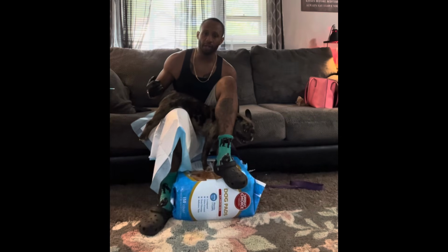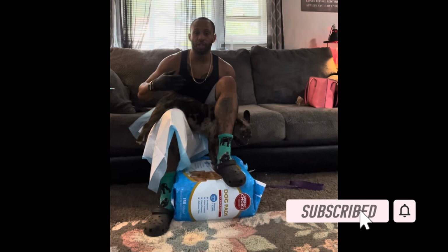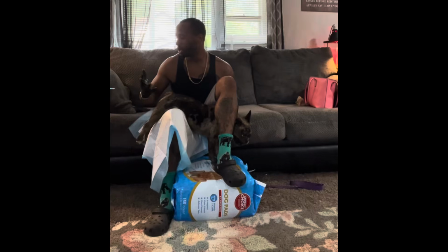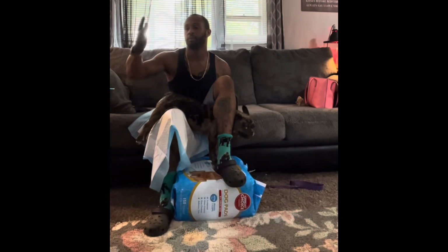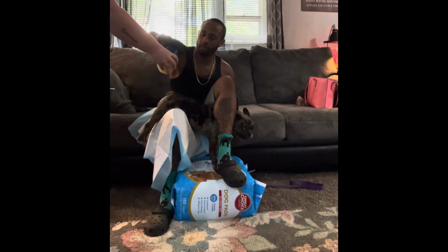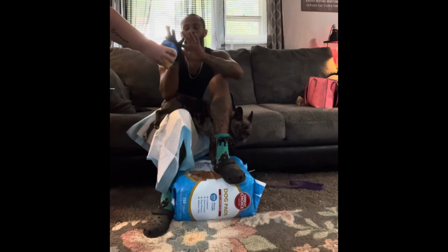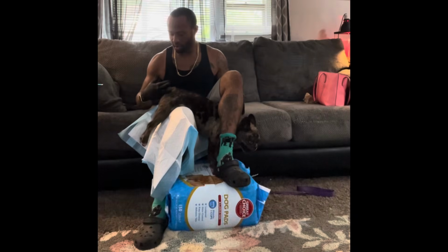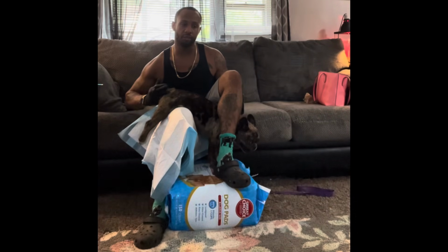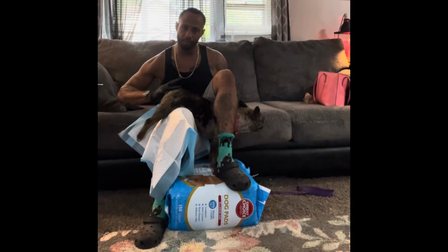So when you do try to insert the catheter, she doesn't jump, because if she jumps and runs away or tries to run away, she's pushing the whole time, so any sperm you injected in there will be pushed back out, and that of course lessens the chance of pregnancy. See, she's relatively calm. She did this a few days ago. So I think she kind of knows what's happening now.